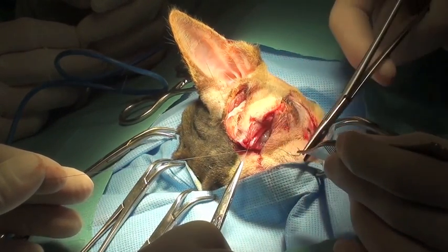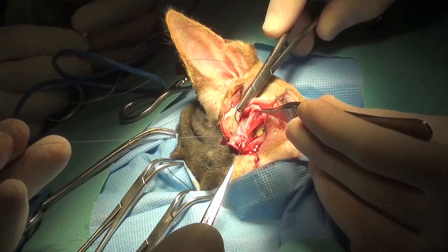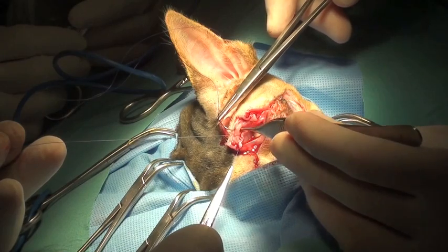The intraoral mucosa from the lip flap is sutured to the conjunctiva to reconstruct the mucous membrane.